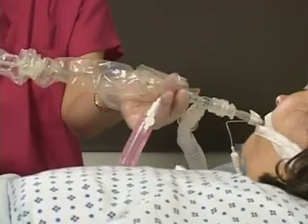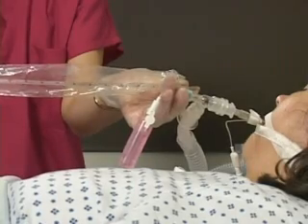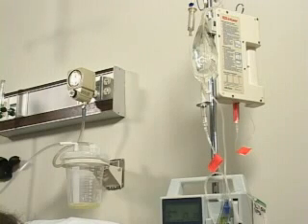This aspiration should not exceed 10 seconds but should be slow enough to allow for mucus to be grabbed by the suction tip. Before suctioning again, pre-oxygenate the client as before prior to another suction pass. To promote clearing of the secretions, ask the client to cough in between suctioning passes, if possible. If the mucus seems too thick to move through the suction tubing, it is not recommended that saline or any other liquid be instilled in the endotracheal tube. In fact, saline and sputum act much like water and oil. If secretions are thickened, then increase the overall hydration for the client and use a mucolytic prior to suctioning.